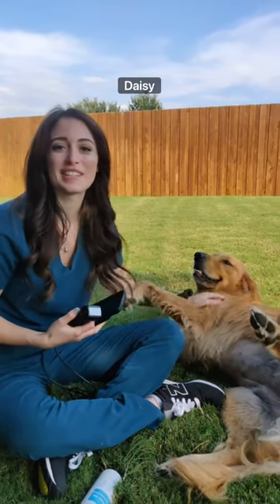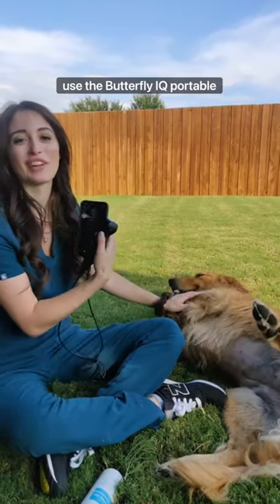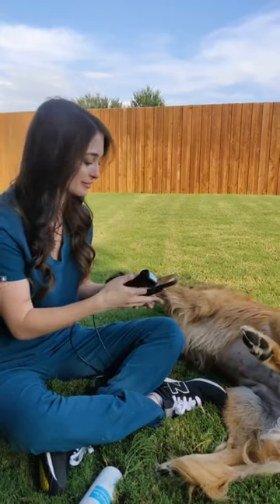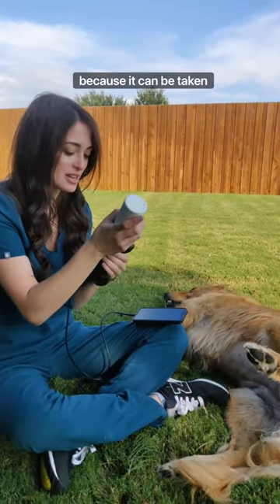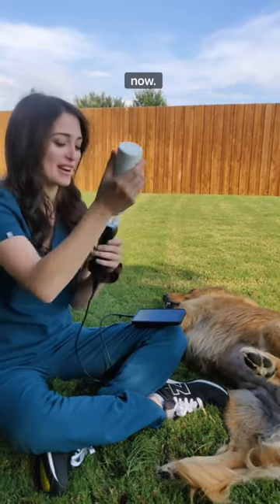Hey guys, it's Dr. Ellard here with Daisy and I'm going to show you how I use the Butterfly IQ Portable Ultrasound. This ultrasound is great because it can be taken anywhere — we're actually in my backyard right now.